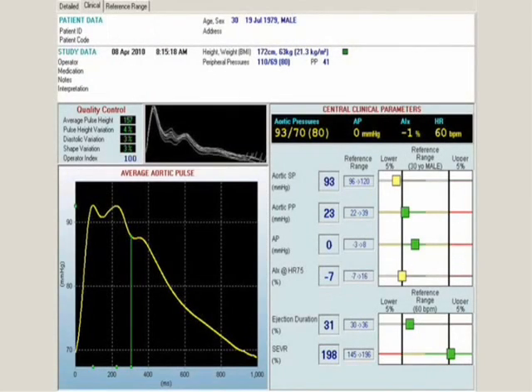The interpretation of these pressure recordings is of interest, because we can see that the subject just recorded — a young male, not overweight, with favorable peripheral pressures brachially recorded at 110 over 69 — has central pressures of 93 over 70, which means a very favorable aortic systolic pressure and an aortic pulse pressure of 23, which is very favorable as well, with the normal range being 22 through 39. From the Strong Heart Study, we know that an aortic pulse pressure exceeding 50 mmHg is associated with untoward cardiovascular prognosis and outcome. His augmentation pressure is also very favorable at zero.